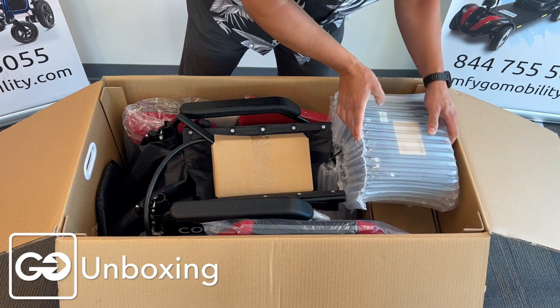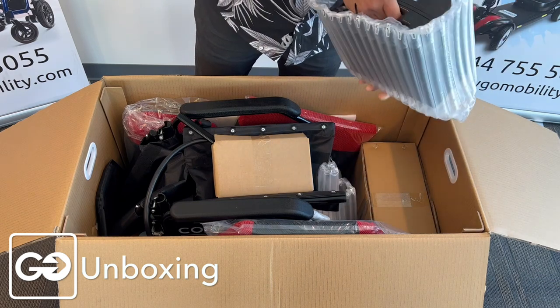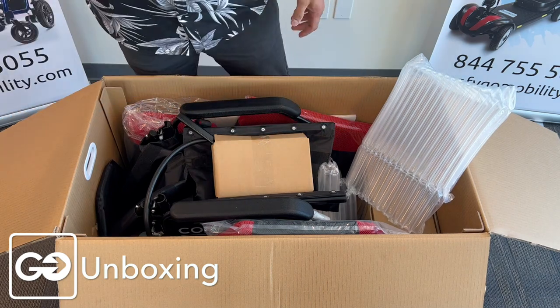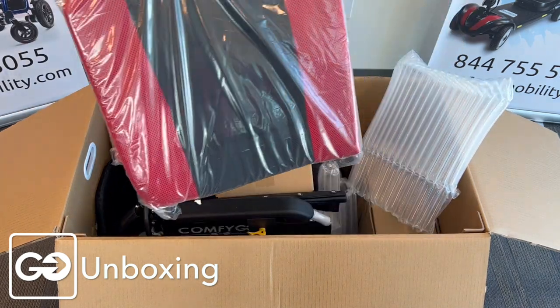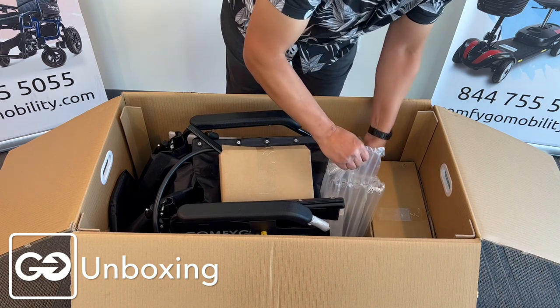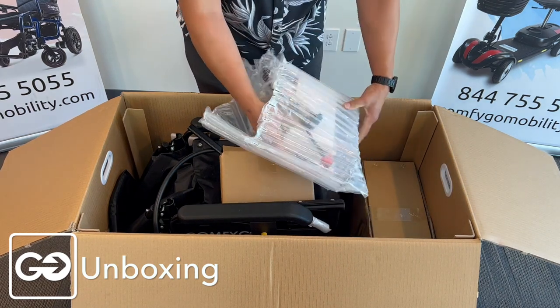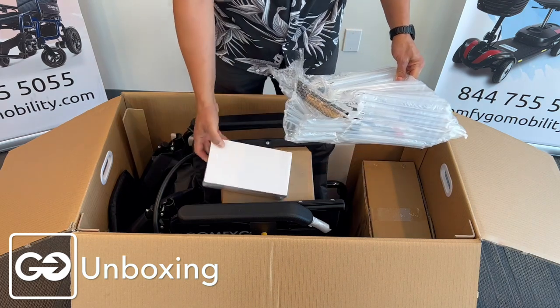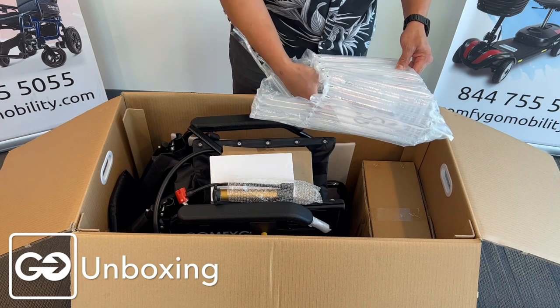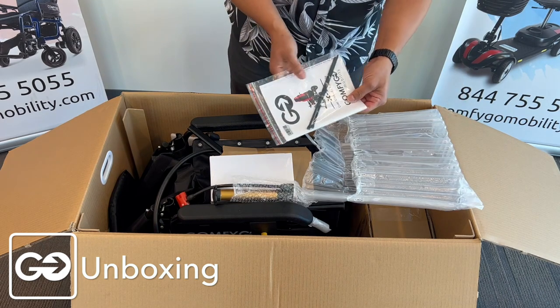I'm going to take a look at the stuff that's in here. First of all, we have the battery, which will be right here on top. This is the standard battery that comes with it — a 12-amp battery. Down below, we're going to have a bag that contains our charger for our wheelchair. You also have the pump that's included with your wheelchair as well.